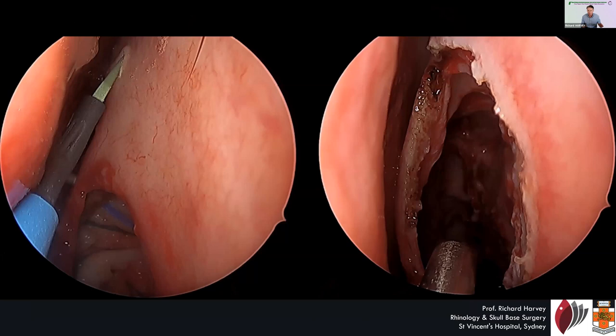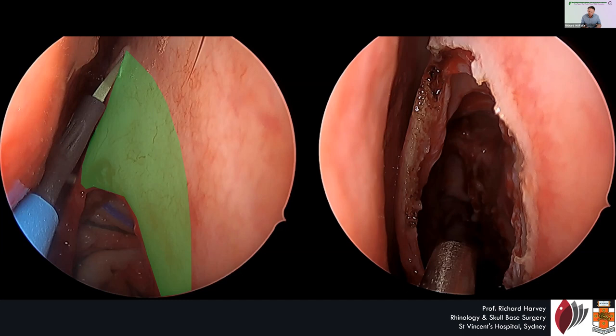We've taken this segment off — the entire axilla gets removed. This is not entirely new; my colleague PJ Wormald talks about doing a little flap here, and Jim Palmer talks about nibbling it with a Kerrison. But what is new, in my opinion, is that we remove the entire bone and do it in a way that gives us much better access.